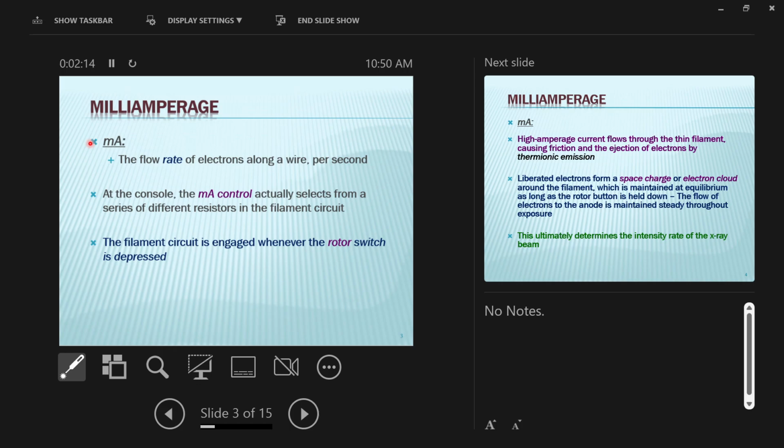So if I have an amp flowing through a wire, that's a number, 6.3 times 10 to the 18 electrons moving past a point every second. If I have 1 milliamp, 1/1000th of that, then I have 6.3 times 10 to the 15th electrons moving past that point in 1 second. So we can quantify exactly what we mean when we say a milliamp. We could say it's this many electrons, okay? Those numbers were accurate numbers, by the way. 6.3 times 10 to the 15 is that many electrons. 6.3, 15 zeros, or move the decimal point 15 places, okay, to the right.